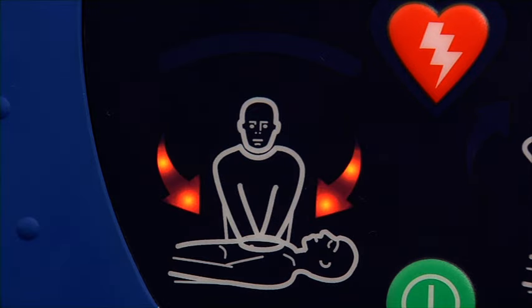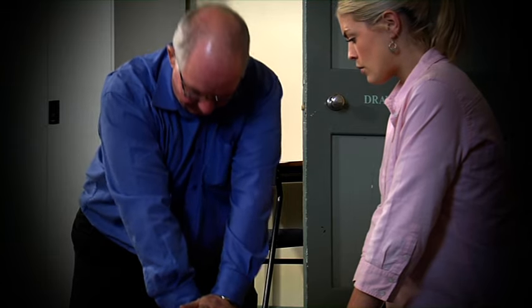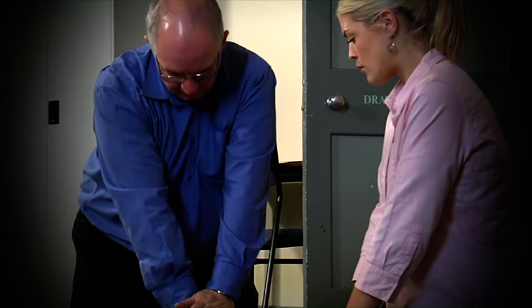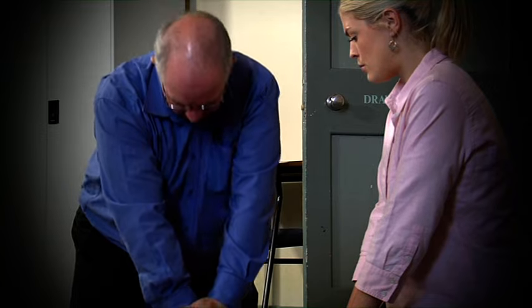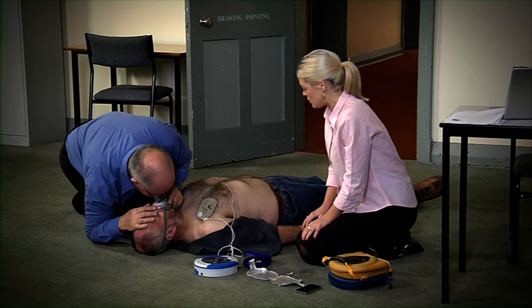Begin CPR. It is safe to touch the patient. Continue CPR until further instruction or until the emergency services arrive. Good compressions. Perform rescue breaths as appropriate and in accordance with your training.